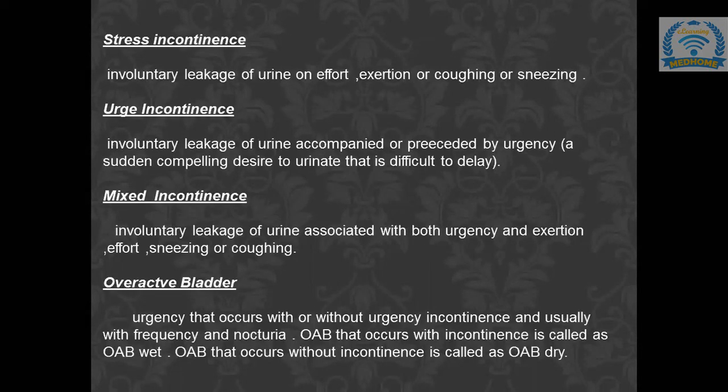Sir, I have a question. Ma'am, in the normal voiding phase, there is a bell shape. In detrusor overactivity or in stress incontinence, what changes occur in voiding? What shape change? There's no definitive shape in case of incontinence, either stress or overactive bladder. There's no specific shape for that.